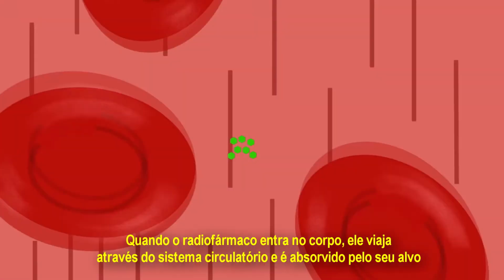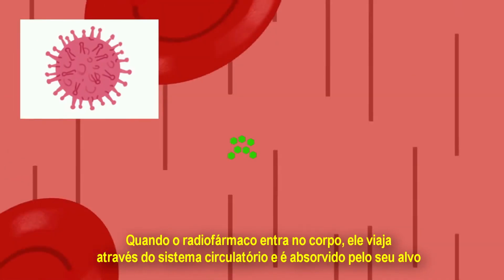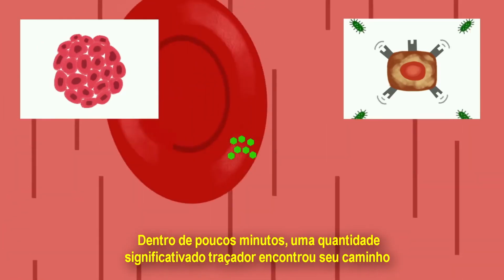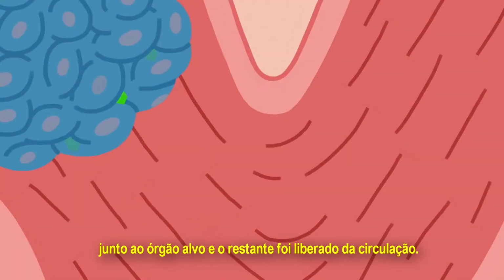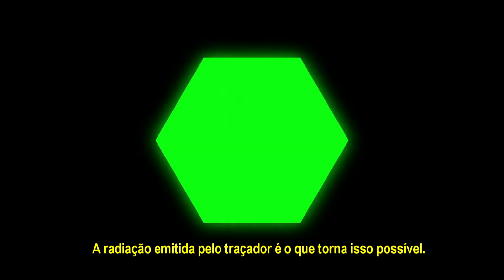When a radio-labeled tracer enters the body, it travels through the circulatory system and gets taken up by its target, whether that's a protein in the brain, cancer cells, or otherwise. Within a few minutes, a significant amount of the tracer has found its way to the target area, and the rest has cleared from circulation. Now the doctors can see their target using a PET, or Positron Emission Tomography, scanner. The radiation that the tracer emits is what makes this possible.